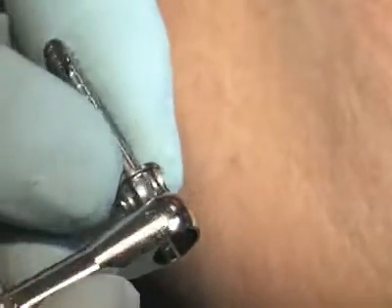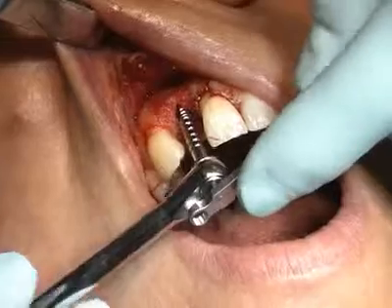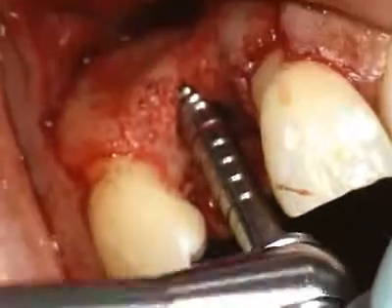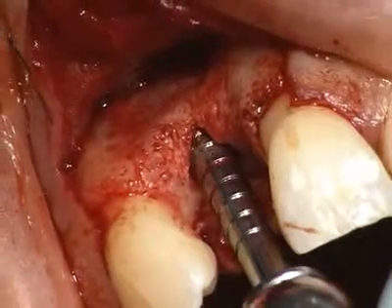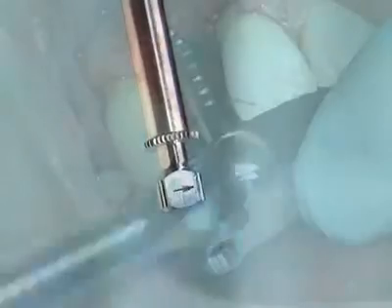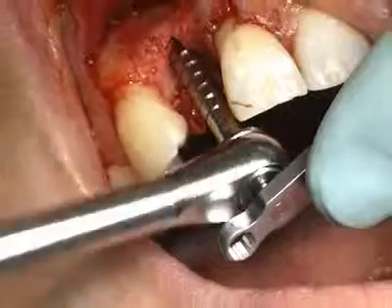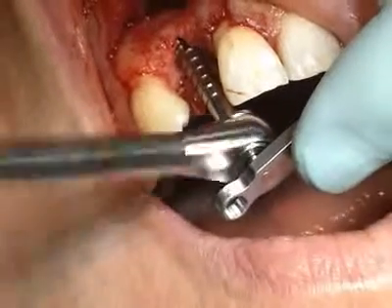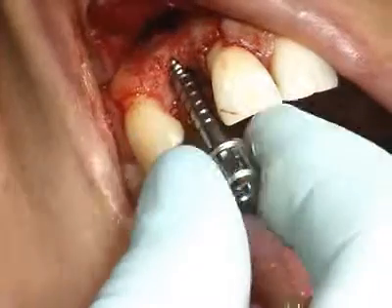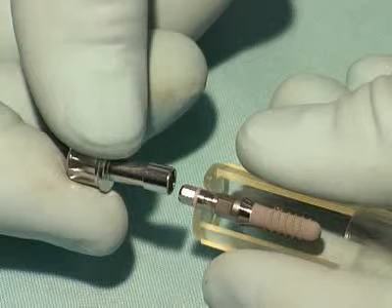To do this, the looped end of the ratchet is placed over the handle of the tap and stabilized with the holding key. The arrow on the ratchet must point in the clockwise direction. When the desired depth is reached, the arrow on the ratchet is changed to counterclockwise and the tap is unscrewed from the implant bed. In this case, use of a Standard Plus implant with an endosteal diameter of 4.1 mm and a regular neck of 4.8 mm is planned.